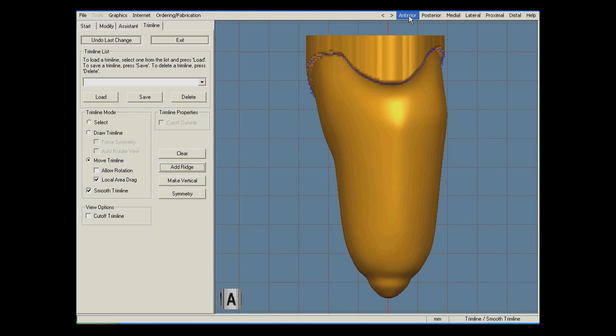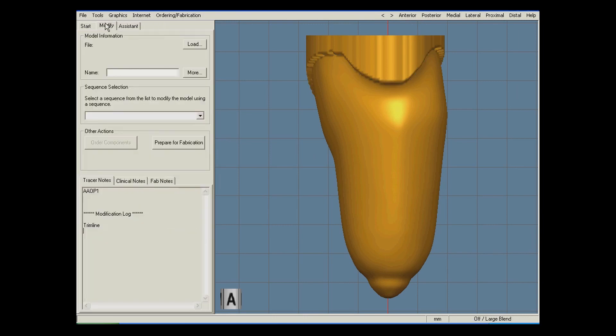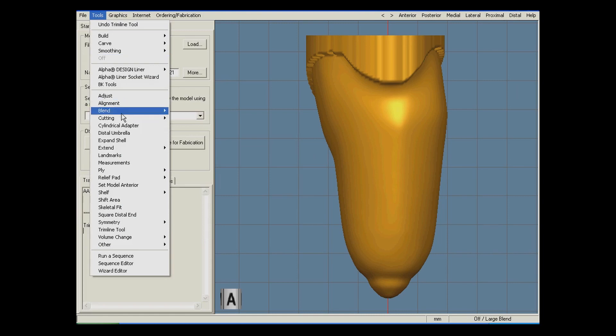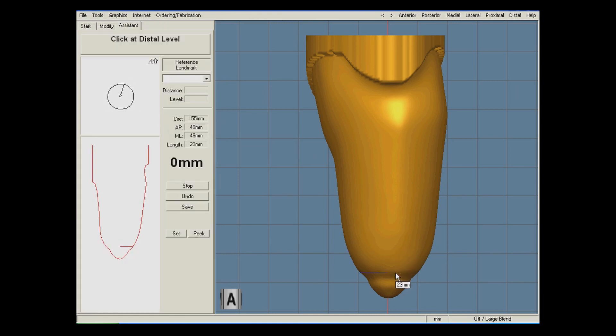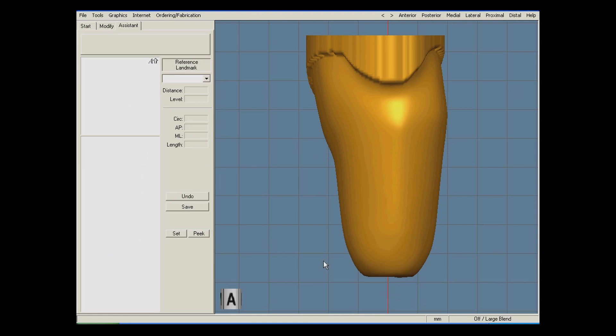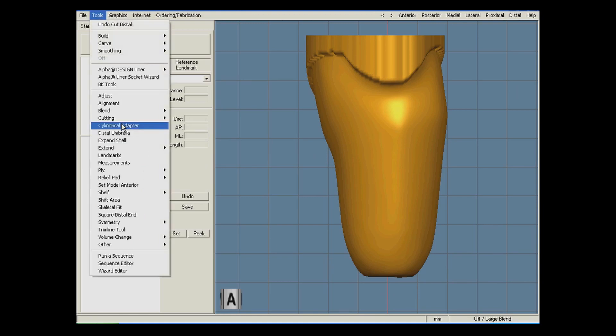With the proximal end of the socket modified, I just need to prepare the distal end. I will start by using the cutting tool to remove the excess volume in the socket from the externally mounted lock used previously.